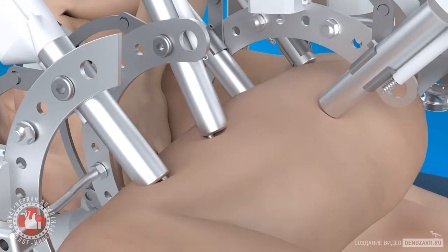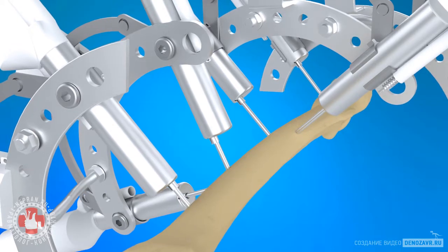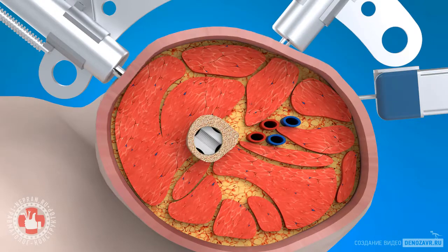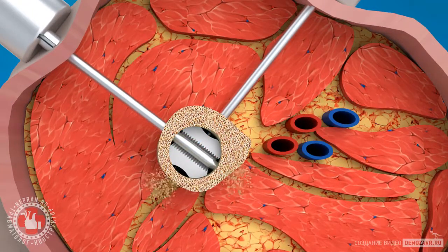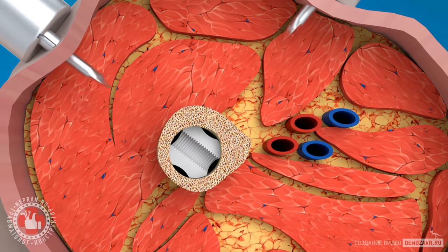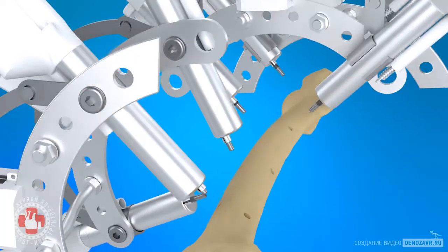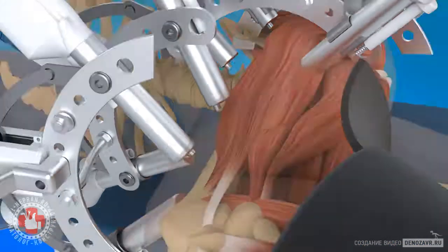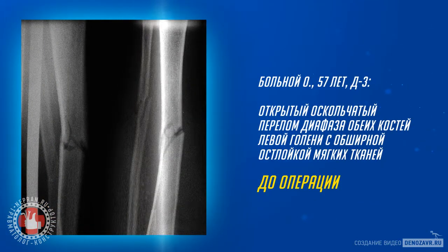after which 8 locking screws screwed into the screwdrivers are inserted into these channels and screwed into the shaft, and not into the bone, until they stop, as is customary until now, which ensures their angular stability. According to this technique, 6 operations have been successfully performed for complex fractures. Such fixation will exclude cases of non-union or delayed consolidation.